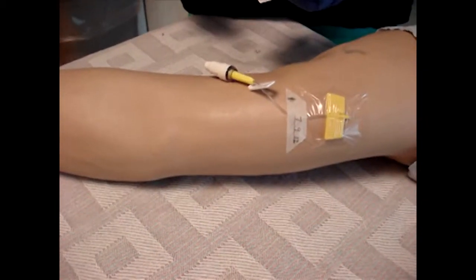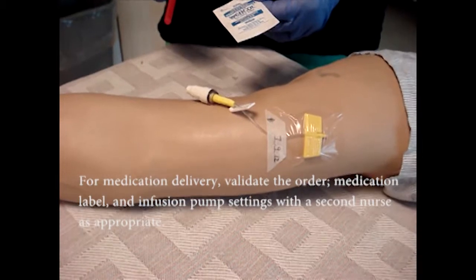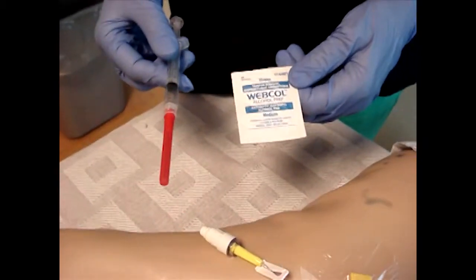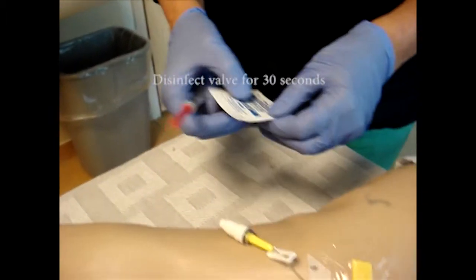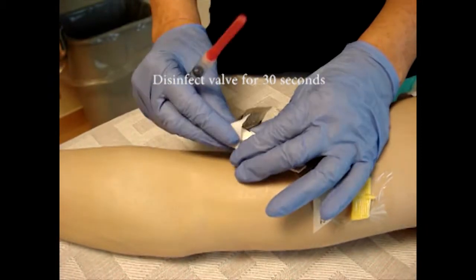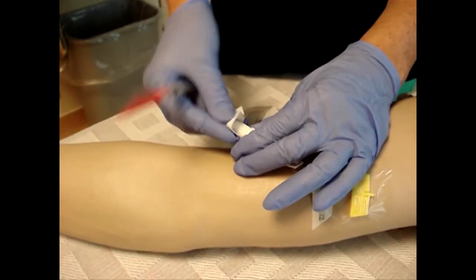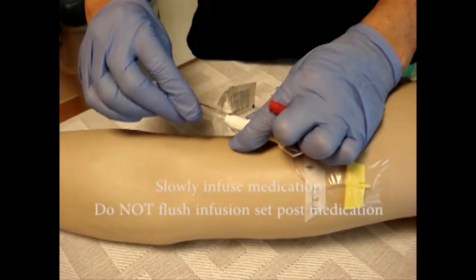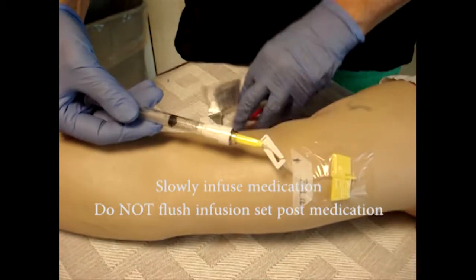Therapy initiation. For medication delivery, validate the order. You will require an alcohol swab and a syringe loaded with the prepared medication. Disinfect the valve using an alcohol wipe for 30 seconds and allow to dry. Slowly infuse medication. Do not flush the infusion set post medication.